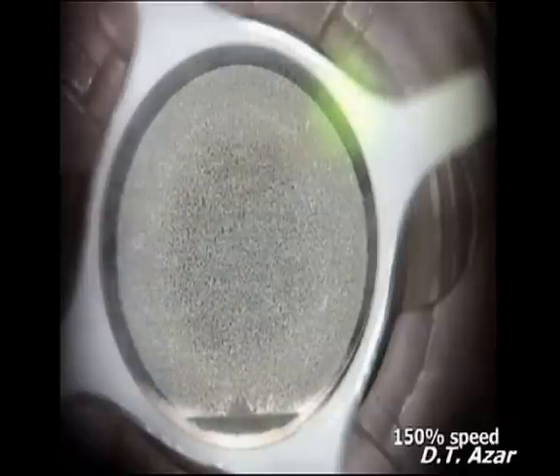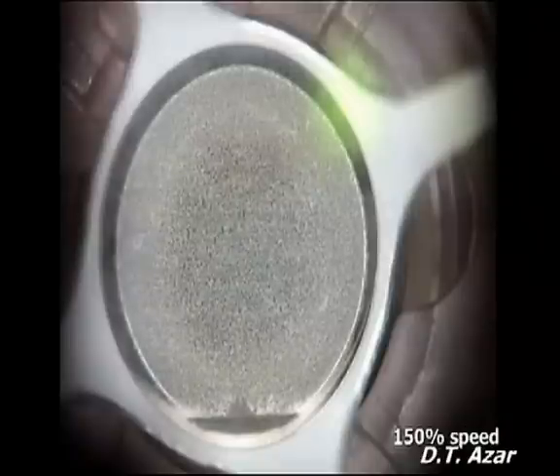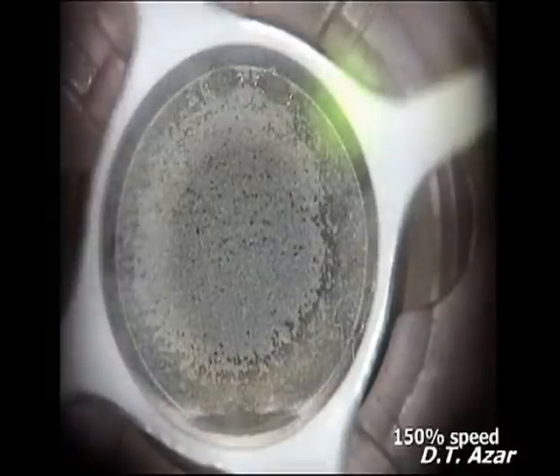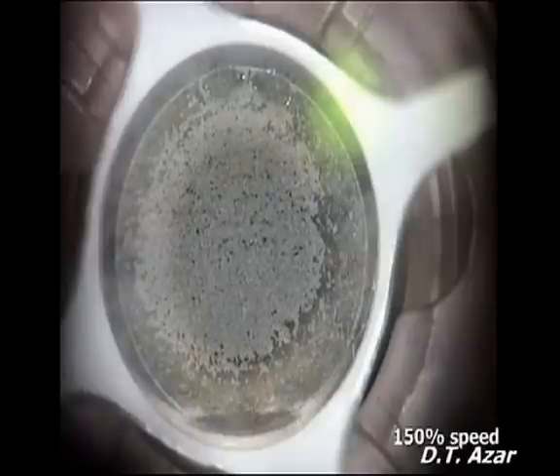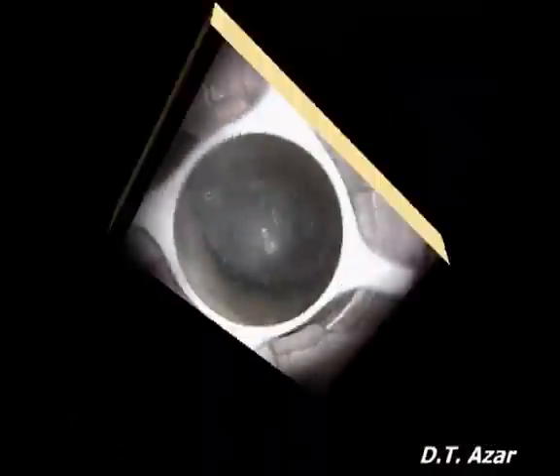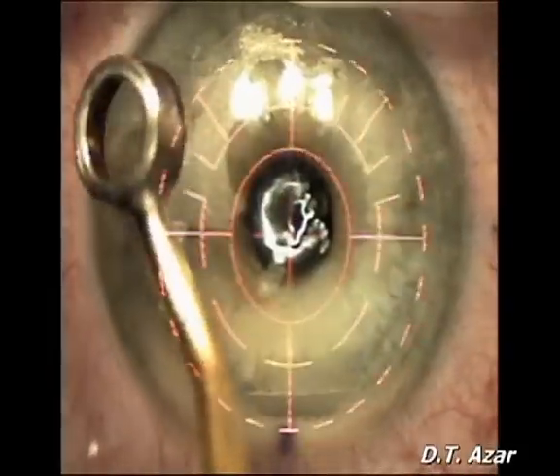The side cuts are then constructed. Suction is broken and the applanating contact lens is removed from the eye. The procedure follows as a usual LASIK procedure.